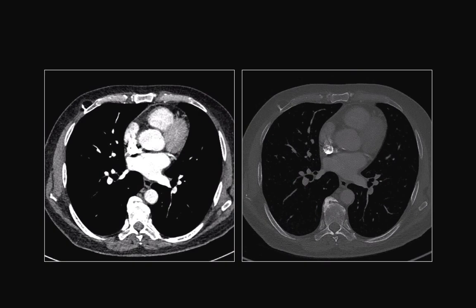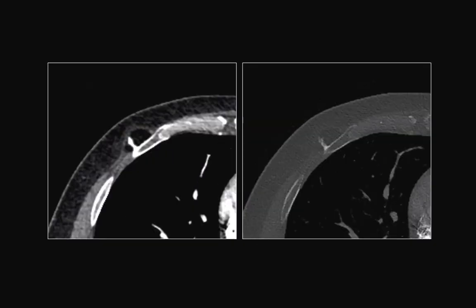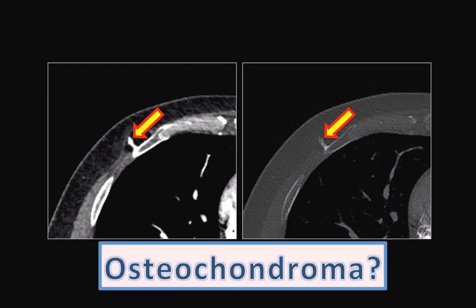You probably noticed that there is an abnormality in the right anterior chest wall. Let's magnify this image. There is a bony spur that arises from the anterior right rib, which makes you think about an osteochondroma.